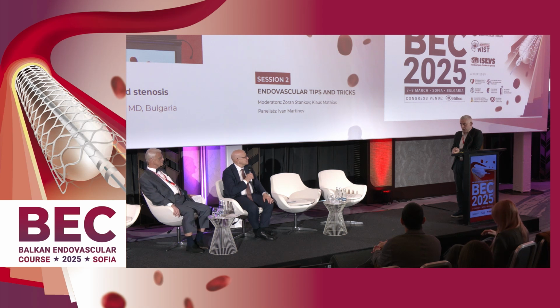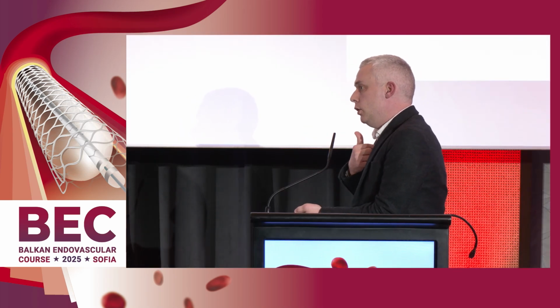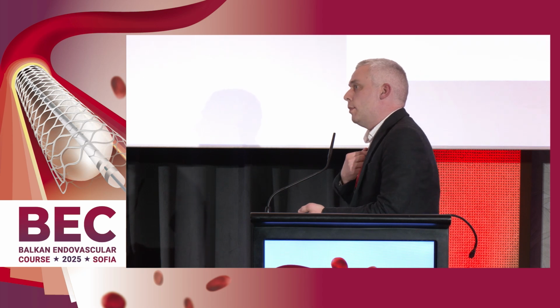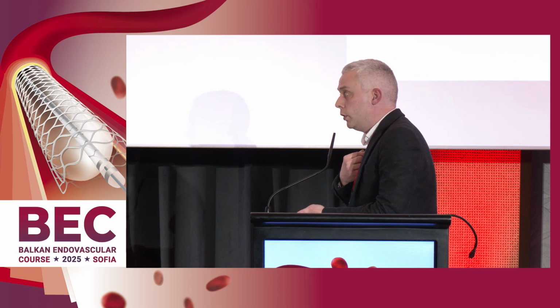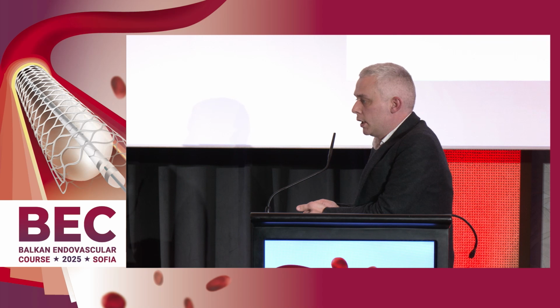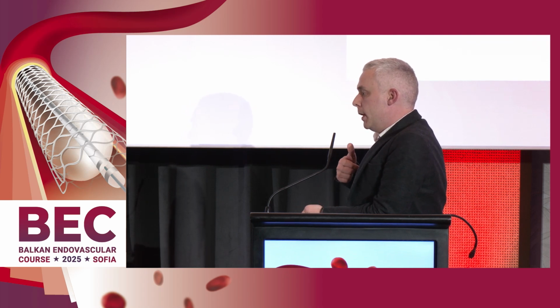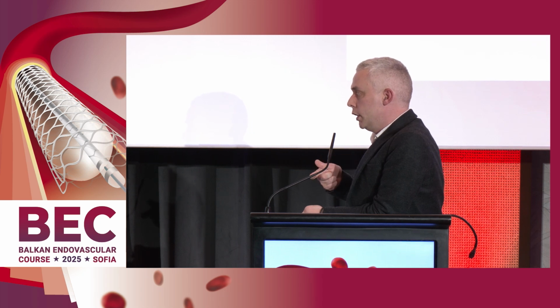Yes, CT is obligatory. Also on the CT, you can have additional information about the aortic arch, for example, because in such a procedure, you must be on the safe side. And in such a procedure, you must plan your approach very well, and you must expect difficult crossing of the lesion. So support is mandatory.